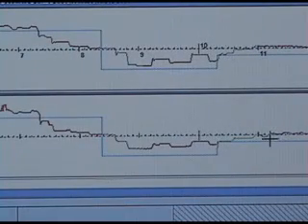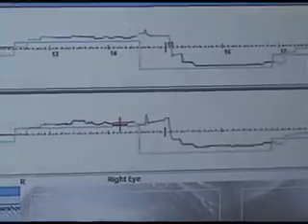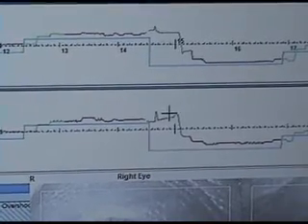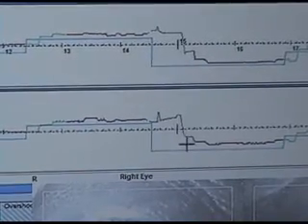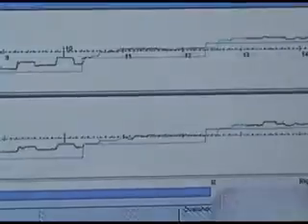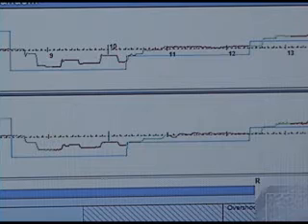And this is the kind of thing that we see with patients with various neurological disorders, whether they're from an injury or whether they're degenerative over time. But we don't like to see saccade testing that has all of this bounciness in between. And then here is an example of someone who, as they're moving their eyes to the left here, does it in almost 3 steps instead of getting there in 1 step. So that's saccade testing, and I hope that'll make more sense to you when we go over your own VNG testing.